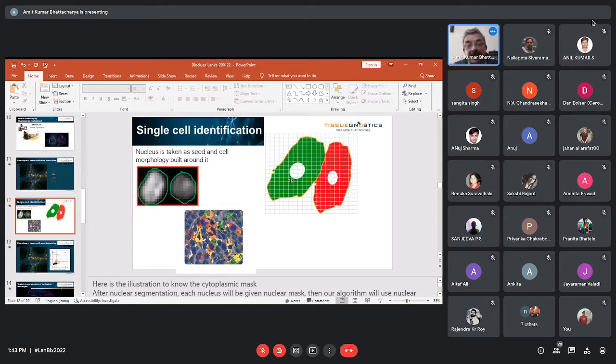I'm sorry, I won't be able to show you here the full slide in the presentation mode, which shows how the algorithm works. Here, the nucleus staining is done, and then the algorithm proceeds to look from the nucleus onwards towards the cytoplasm and towards the membrane periphery, and looks for signals. As it goes, it keeps on looking for signals, and then it hits the membrane boundary and stops. And therefore, it can make out the true morphology of the cell.